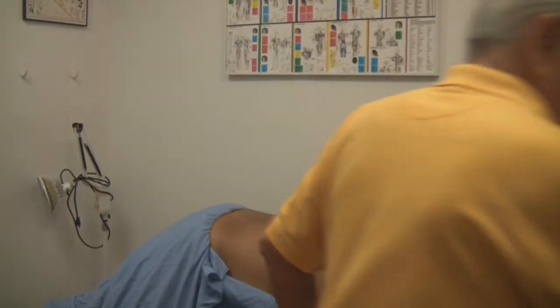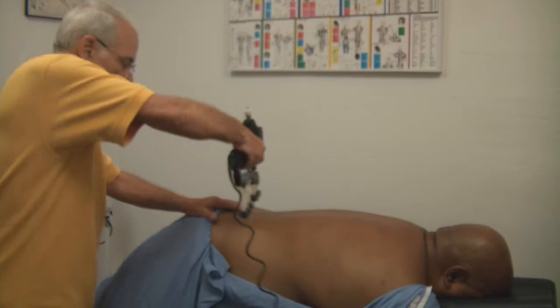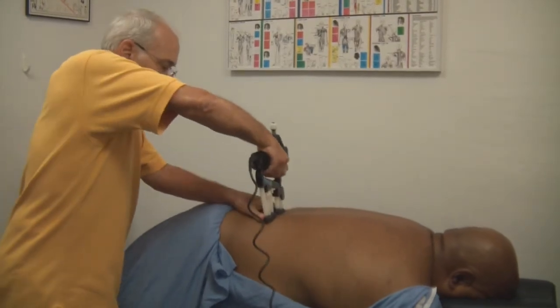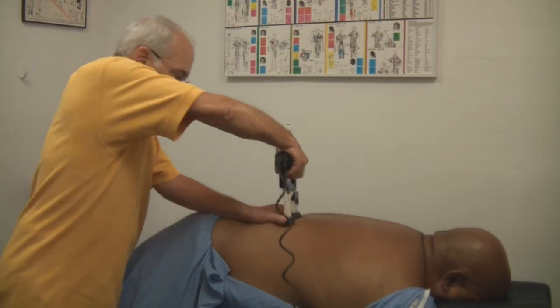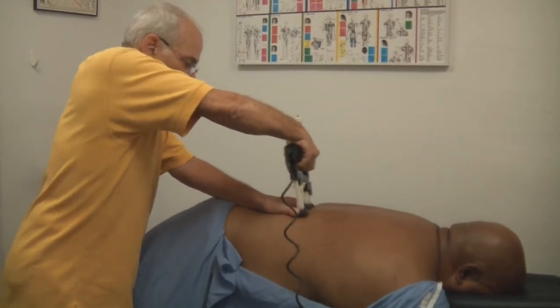Now I'm going to use this unit here. How does this feel to you, sir? Great, doctor. Do you like this? Mm-hmm. Take it home? Yes.